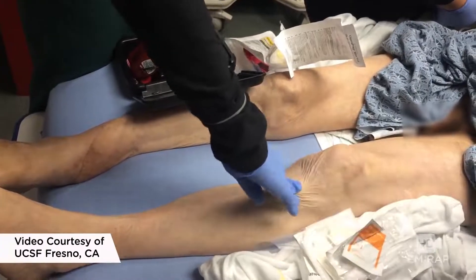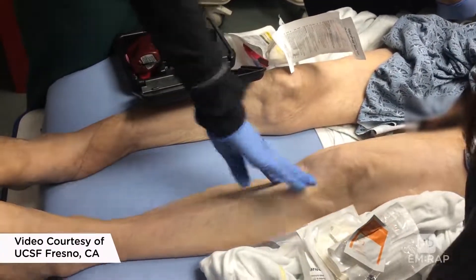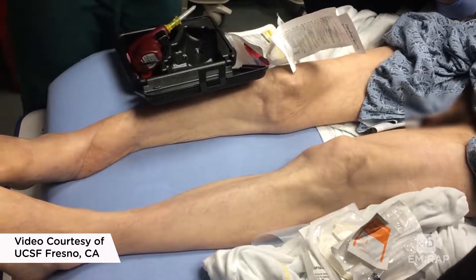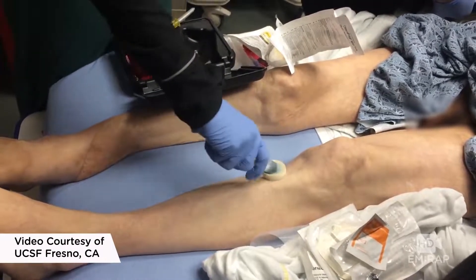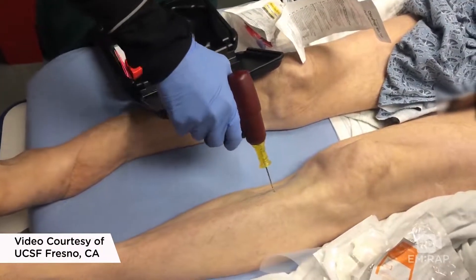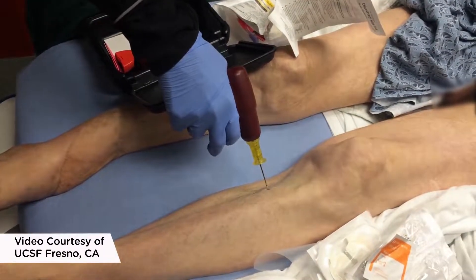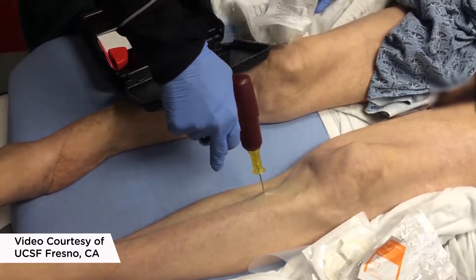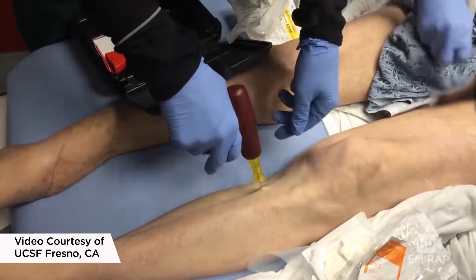For the proximal tibia, you want to feel two finger breadths below the tibial tuberosity on that anteromedial surface. Prep the skin first. With your drill — here they're using the yellow one, though the blue would also work; yellow might be a little long, so you just don't want to hub it — advance it through the skin and drill until you feel give.